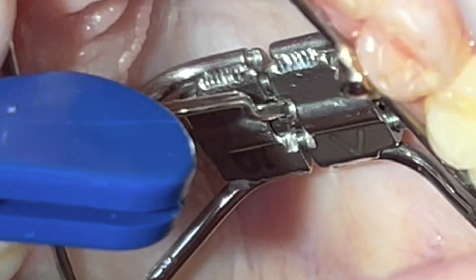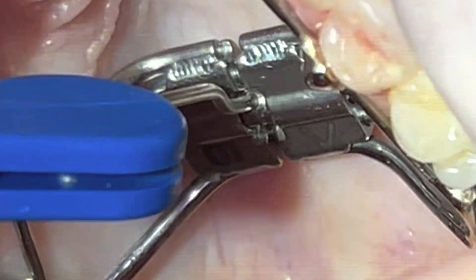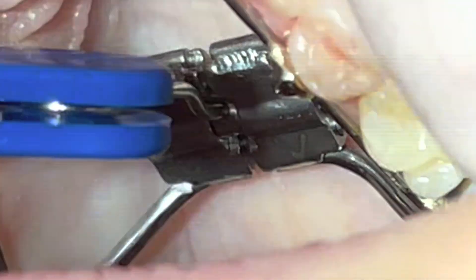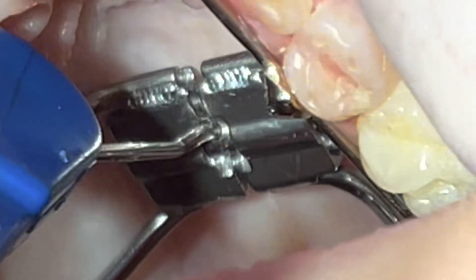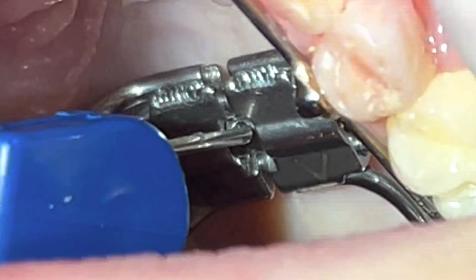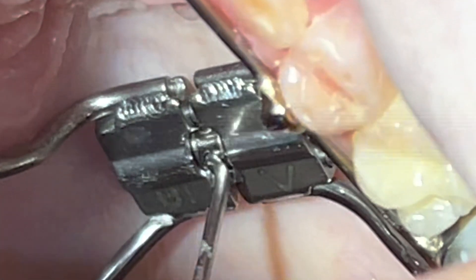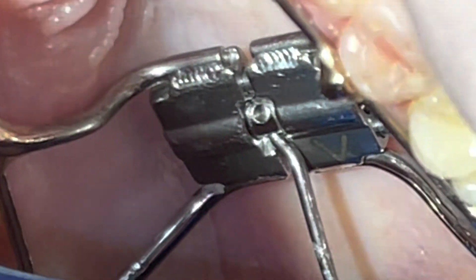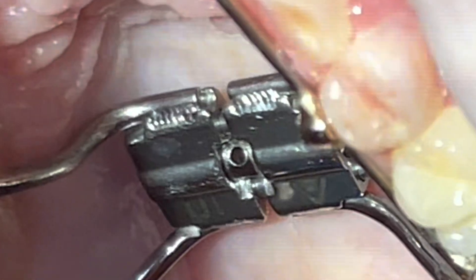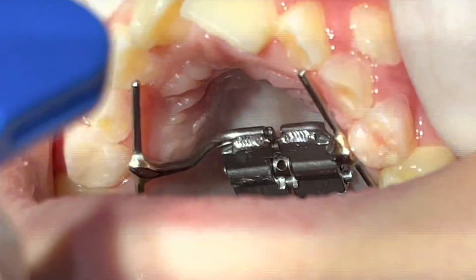At the installation visit, I do up to six turns depending on the patient's age and resistance. If the patient can afford it, we can do up to six turns at the beginning, and then I ask the patient's parent to do one turn in the morning and one turn in the evening — we can skip sometimes if the patient has a headache.